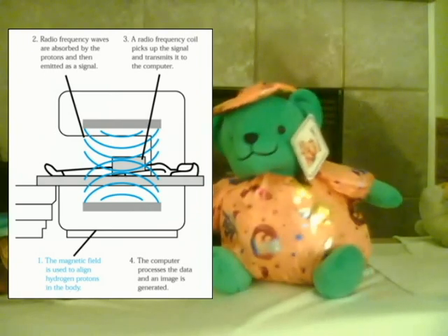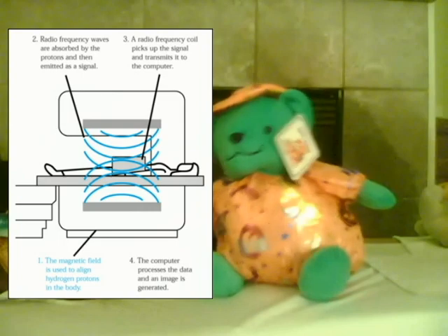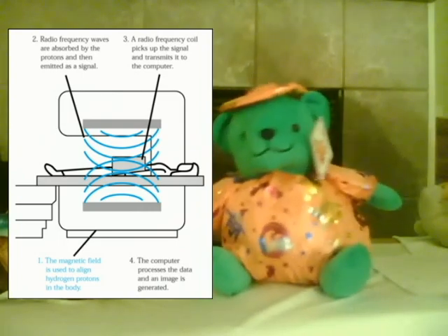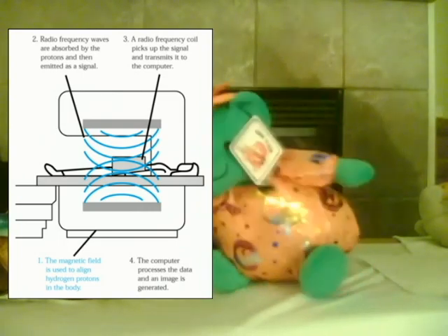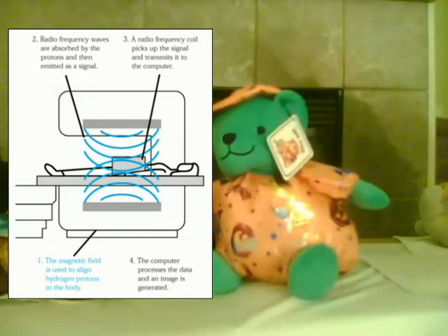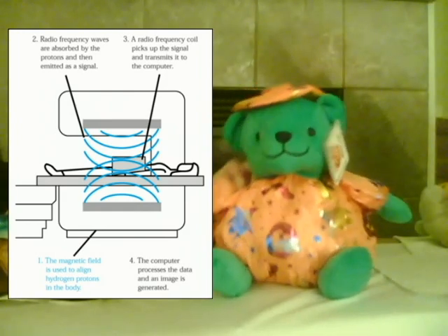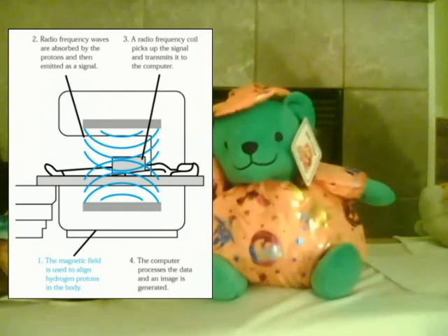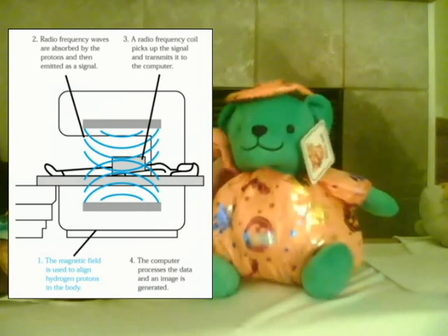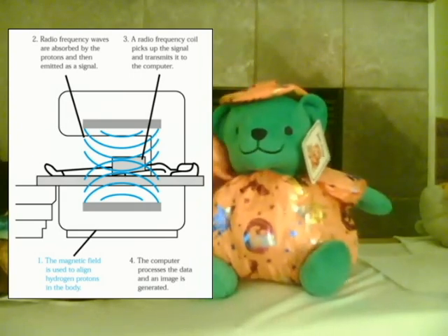The MRI machine contains a gradient magnet that superimposes a magnetic field on the body in 3 perpendicular directions. The body itself is made up of water and fat, so protons are plentiful. When the magnet is turned on, the protons align with the magnetic field and the radio frequency pulse is applied, which then aligns any protons that did not align.